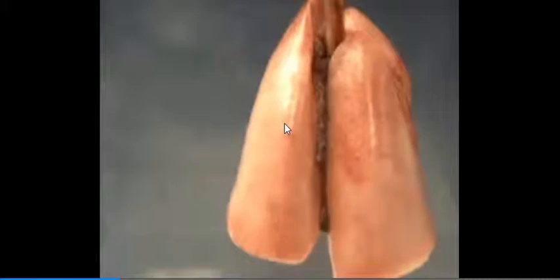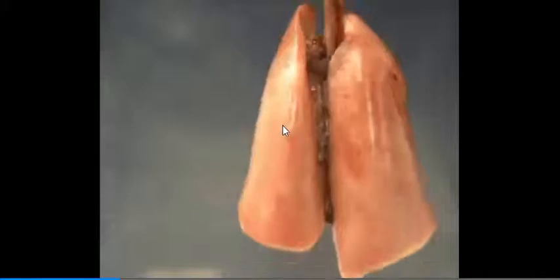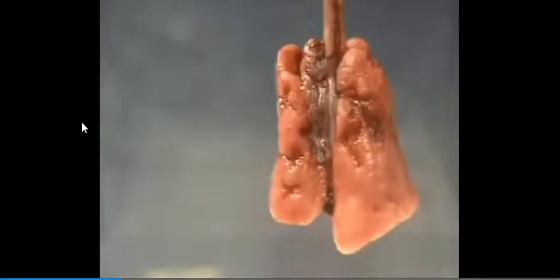Atelectasis, or the collapsing of alveoli, is being worked against so that all that alveoli can be utilized to move oxygen past that vasculature. That's what it's all about. It's about moving oxygen past that vasculature. Now look at it. 0 PEEP, and everything goes away. Stuff starts to break down again, and stuff's not being utilized. And then he adds PEEP again. So PEEP is very important.